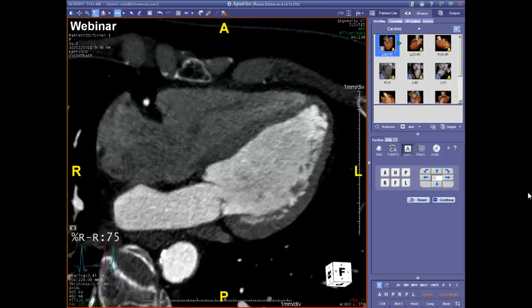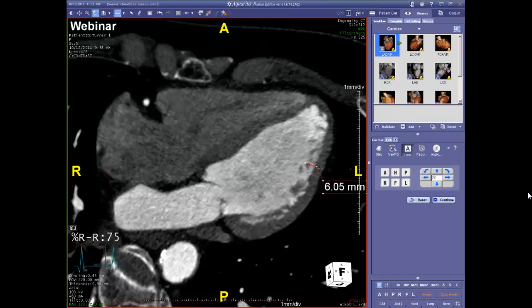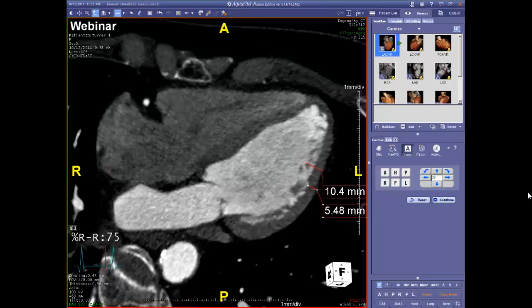I'll use some of the echo criteria and draw the distance between a crypt - from this point here to the epicardial surface. Then let's look at the thickness of the myocardium itself and pick an area right here and draw that to the surface. The point is that we're very close to this two-to-one relationship, which I think was derived from echo studies. So is this a non-compaction of the left ventricle or a portion of the left ventricle? I think this patient probably does meet the echo criteria for this.